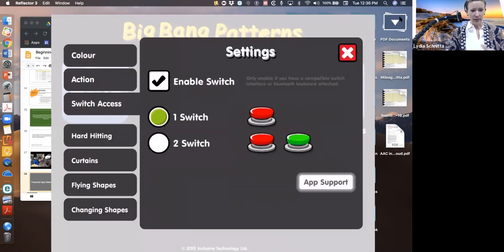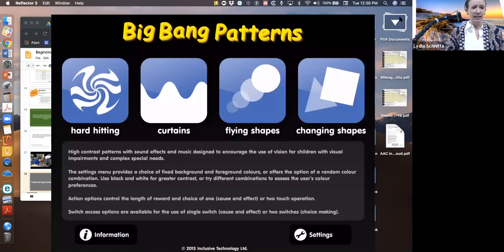with one switch. And this doesn't have the option to do that momentary play where you hold it down, which is an optional step. If the student's having trouble making that connection, you might back it up and make sure that you do that step. But you can use these steps sort of interchangeably, fluidly, just however to meet your students' needs.